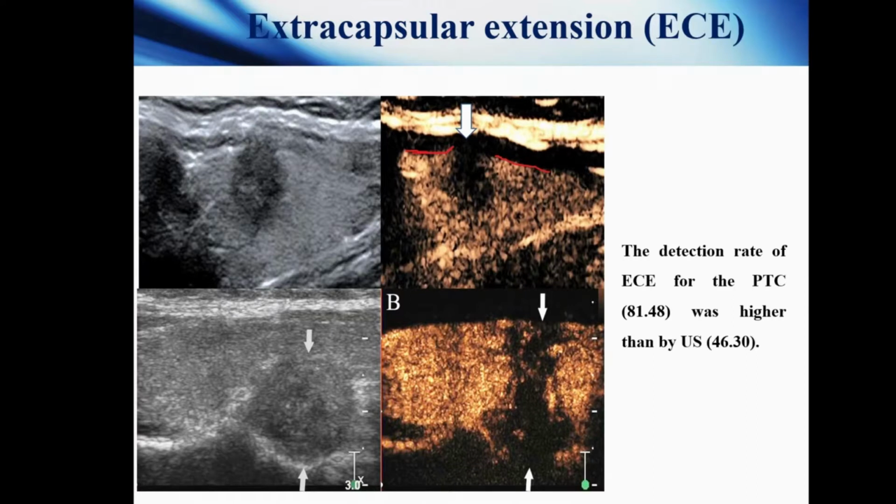The extracapsular extension of thyroid tumor can be evaluated by CEUS.